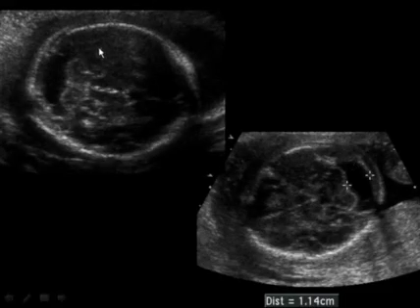Here's a megacisterna magna, a large amount of fluid in the posterior fossa cisterna magna region. Notice the little crossing septations here and here. The measurement is 11 millimeters, but we have a well-formed cerebellum and a midline vermis.